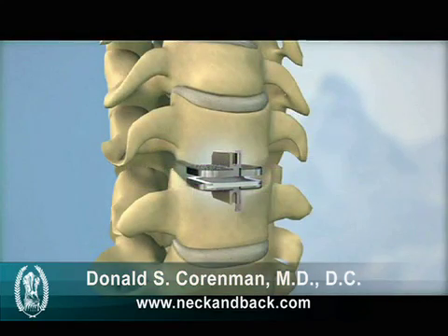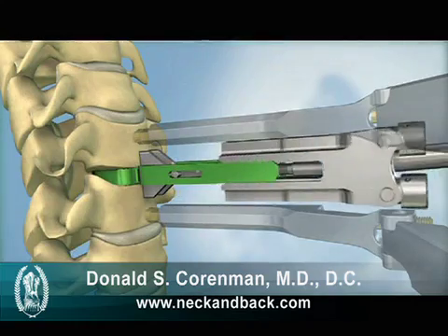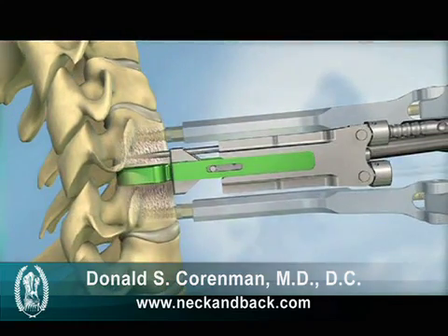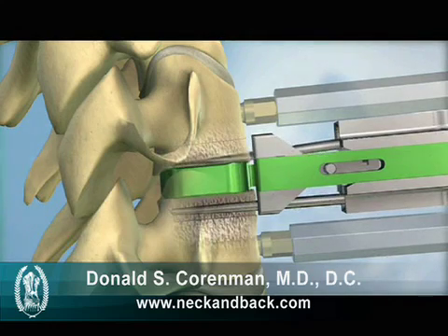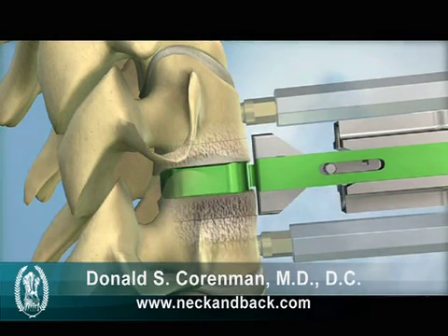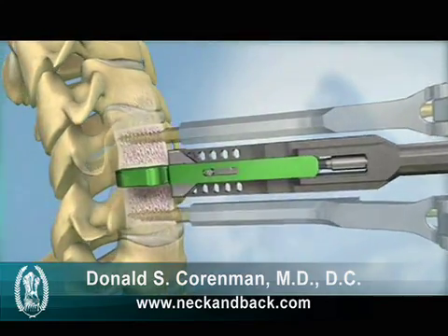Next, keel channels are prepared in the vertebral bodies above and below the disc space. The keel channels for the ProDiscC implant can be prepared using either a milling technique or a chiseling technique. In the milling technique, a milling bit is used to create the channels for the ProDiscC keel. The chisel technique utilizes two chisels to create the keel channels.